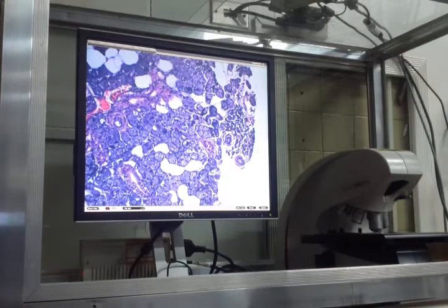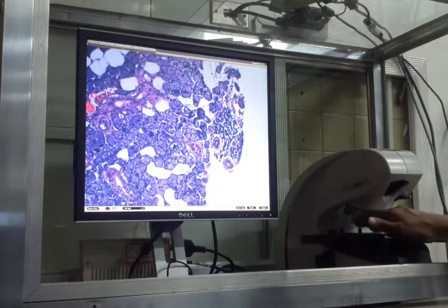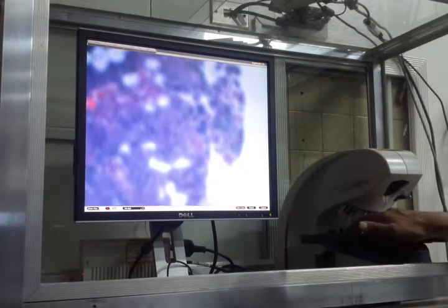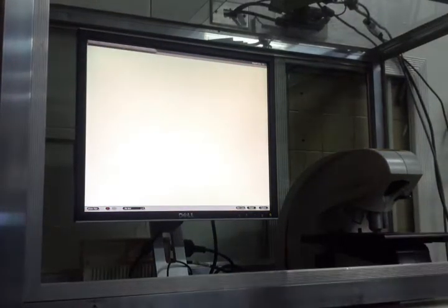Ayan. Look at this area here. You have an area with small blood vessels and you have lymphocytic infiltrates. This is a blood vessel, and you have lymphocytic infiltrates in the area. These are the serous acinar cells. This is a ductule. Okay? If they focus this, it is the model used for SLE in the laboratory. This is the only slide showing you a hypersensitivity type 3.